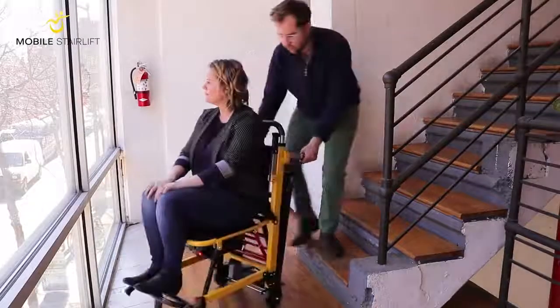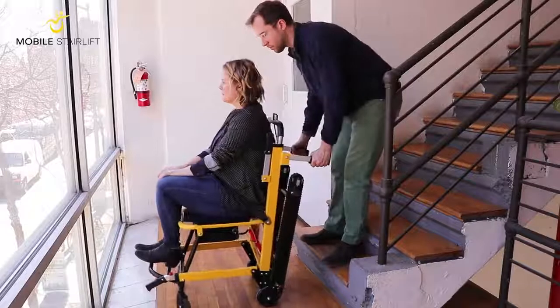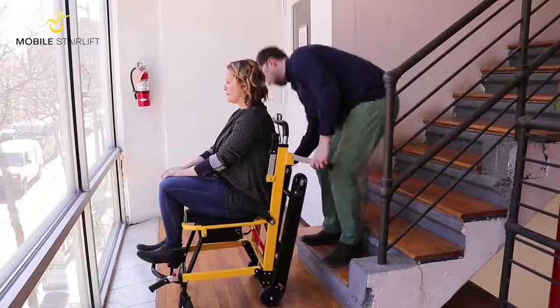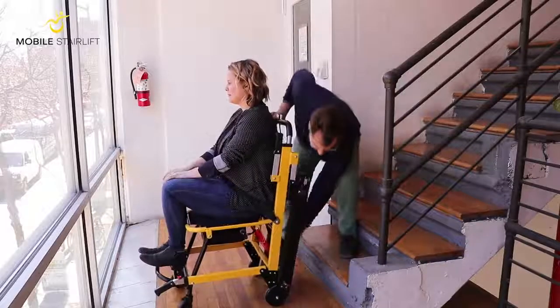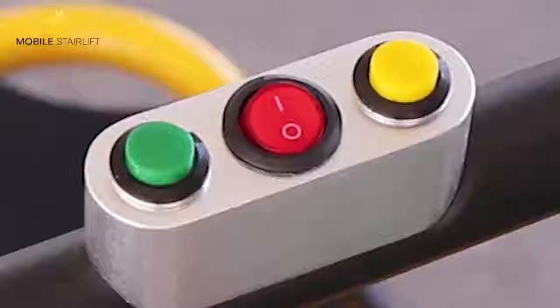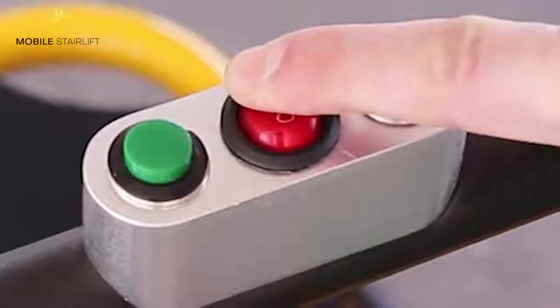To ascend a staircase, back the stair lift up to the staircase and stop when the treads are approximately 10 inches from the bottom stair. Push the red track handle towards the arrow to pull the track away from the stair lift until it locks into place. Power on the stair lift by flipping the red switch on top of the handlebar to the on position.